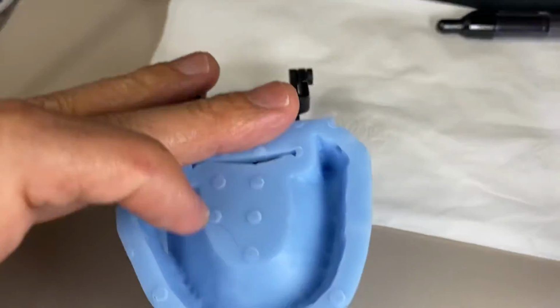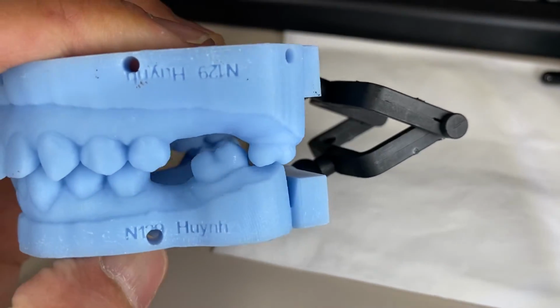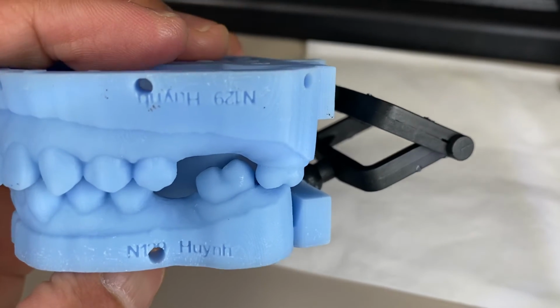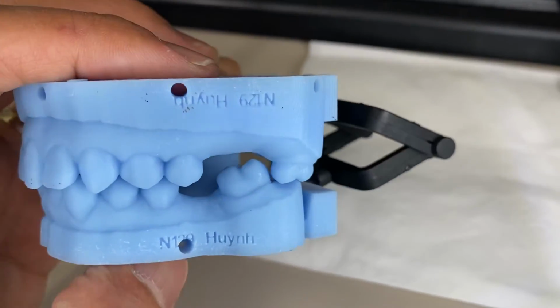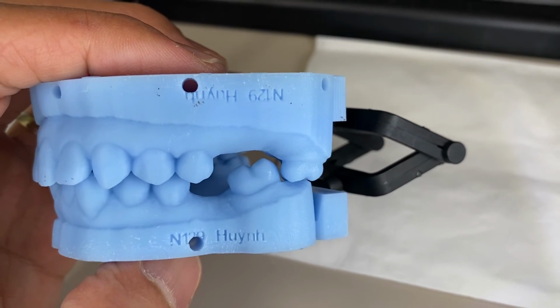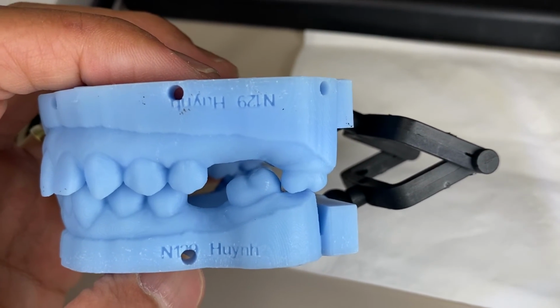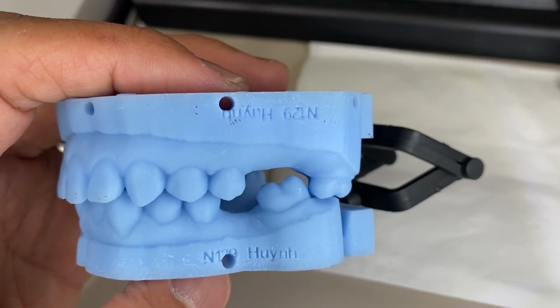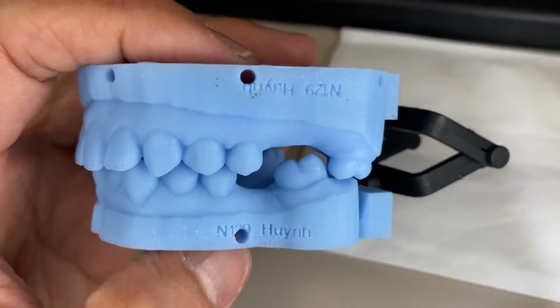The major problem with the upper teeth is that number 16 has really super erupted and almost touches the gum of the number 17 area. I told her that we will have to discuss how we're going to move it forward. We might have to put in an anchorage implant to pull it upward and then forward, or we just have to pull the tooth, depending on her choice. If she doesn't like the implant, then that's what we have to do.